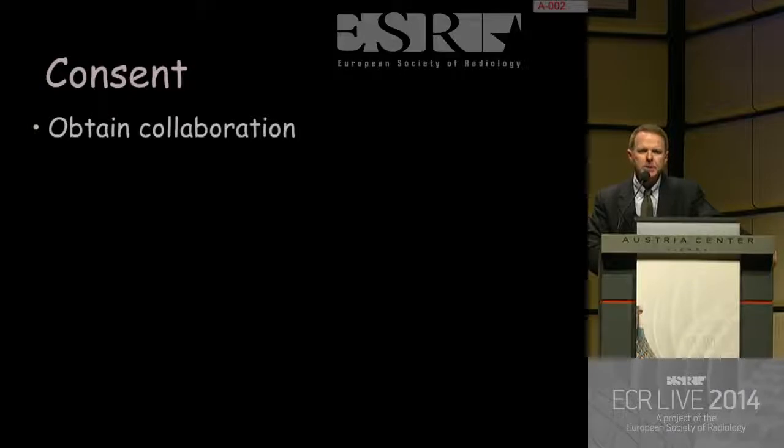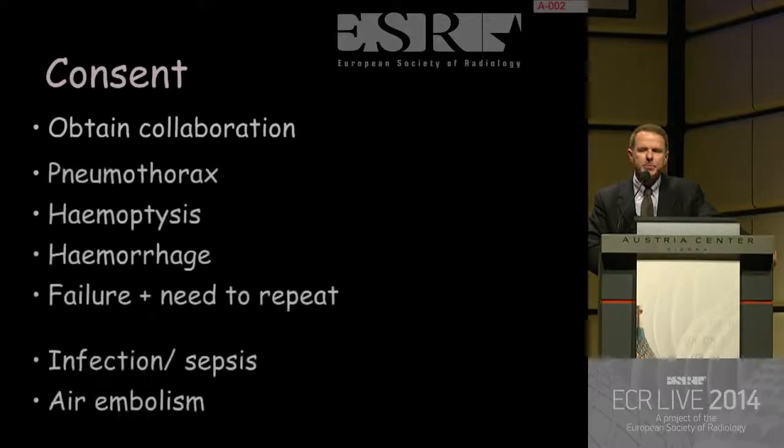Obtain collaboration, introduce yourself, explain what you're going to do. Of course, you have to explain the bad things: pneumothorax, hemoptysis, probably hemorrhage. Maybe I'm not going to get tissue and we have to reschedule you in 10 days. I'm sorry. Sometimes you have to mention even more rare complications, which are more dangerous.